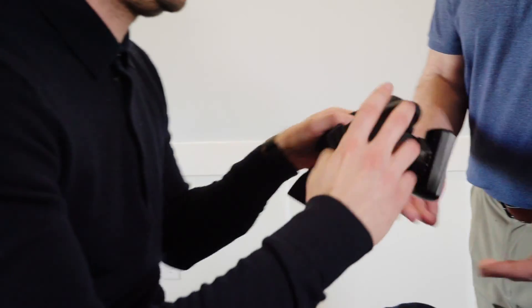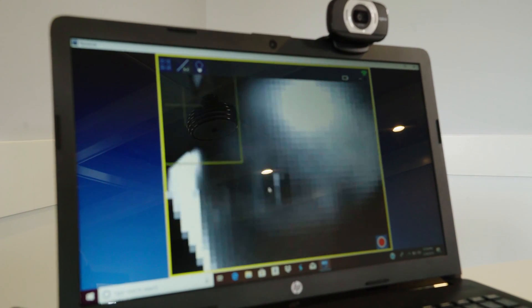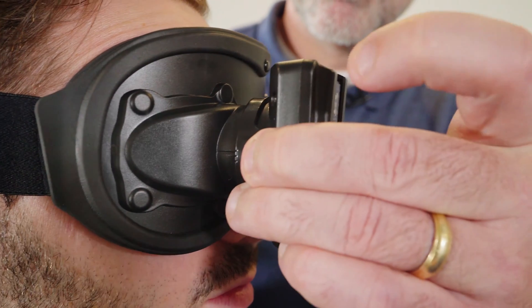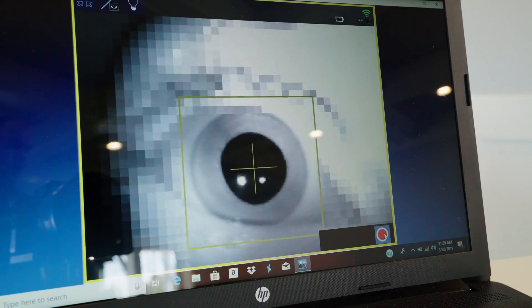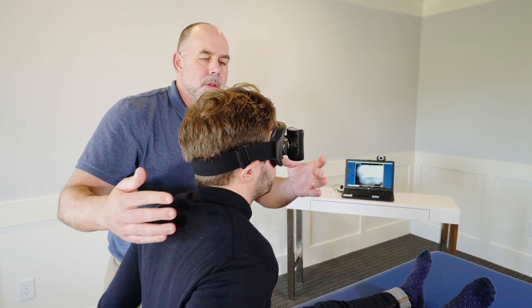We're going to hand the goggles to the patient and allow them to put them on. Then we're going to adjust accordingly, making sure that we've got the best position to acquire data. And now we're testing.